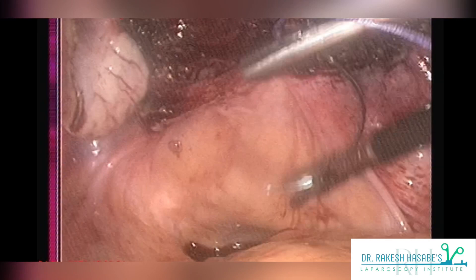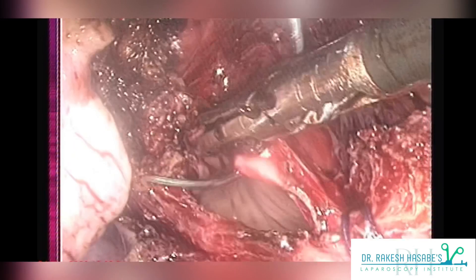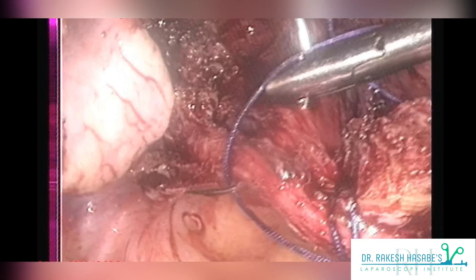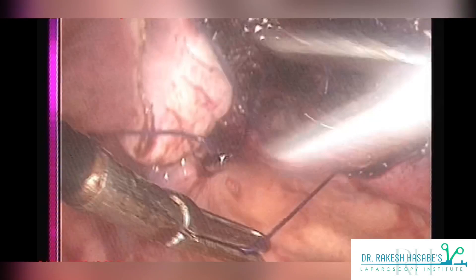Again you can see how to catch hold of the needle — hold the tip of the needle using your left-handed instrument and using your needle holder hold the needle at the junction of two-third one-third. There are two or three ways of performing laparoscopic vault suturing: you can close the vault by taking continuous sutures or interlocking sutures. I believe in taking all interlocking sutures because they are hemostatic as well. Don't forget to include paracervical fascia anteriorly and peritoneum posteriorly, as paracervical fascia definitely has a proven role in preventing future vault prolapse.